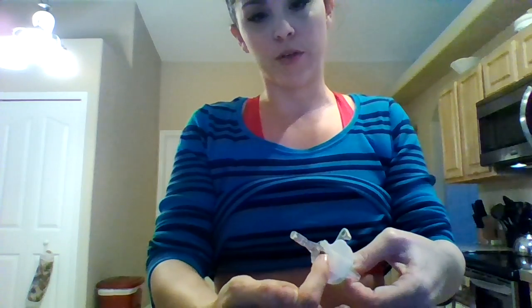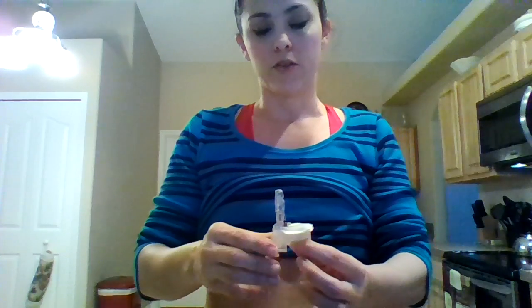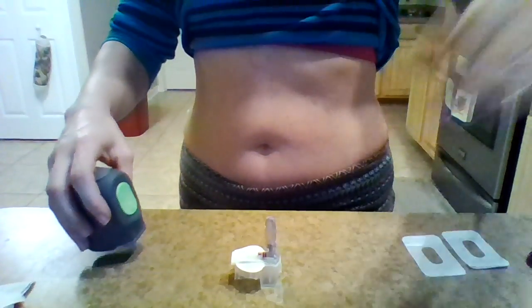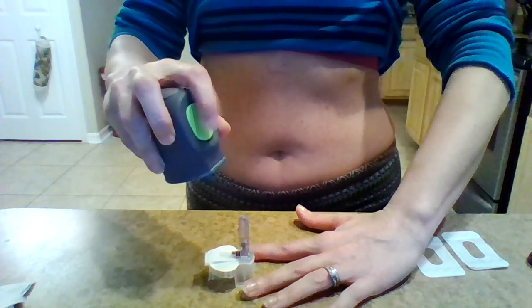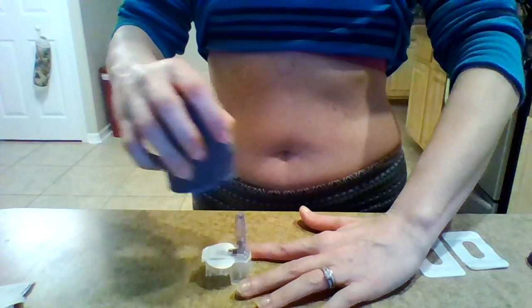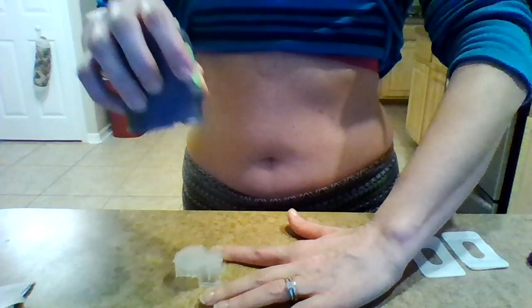The transmitter is going to hook onto this little part, you'll see that, and then this needle is going to come out. So the first thing that I do is I'm going to set it on the counter to do this, so you're not really going to be able to, well, you know what, maybe you can here. So there we go. Hopefully that'll show. If not, I'm sorry. Okay, so you want the green little pushy button thing to be facing the front, where the needle is, and this is the adhesive. So you just stick it over top of it and you pull it out.